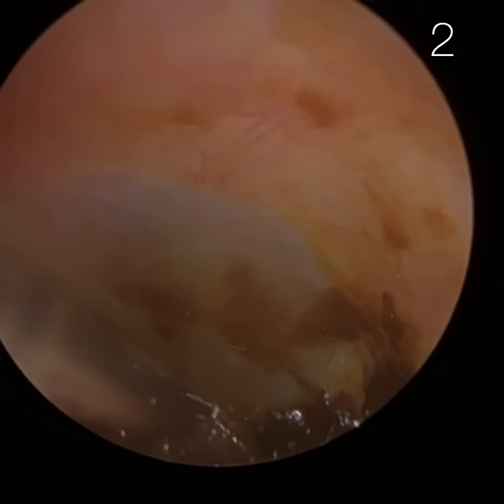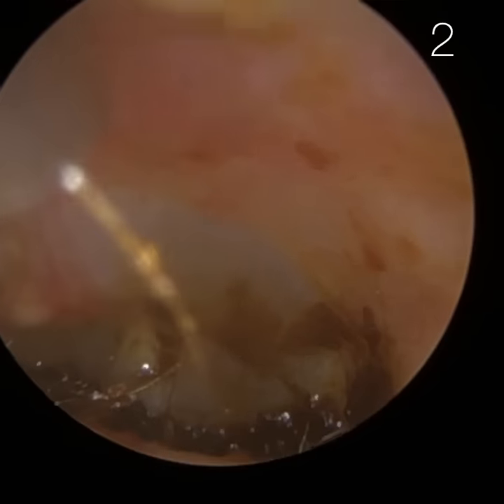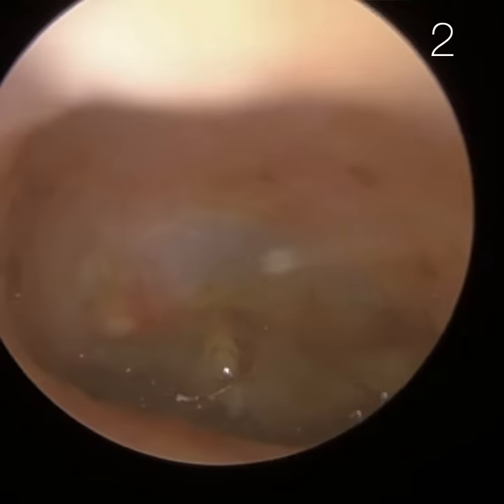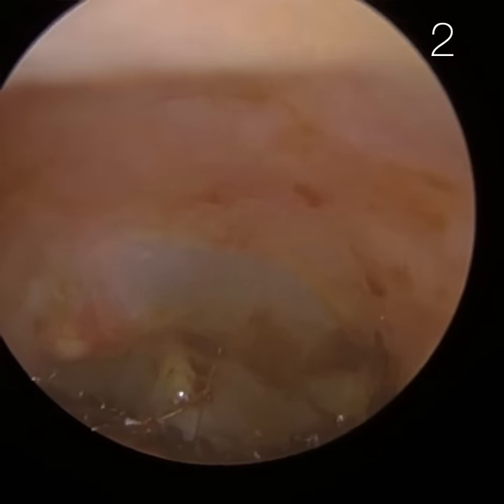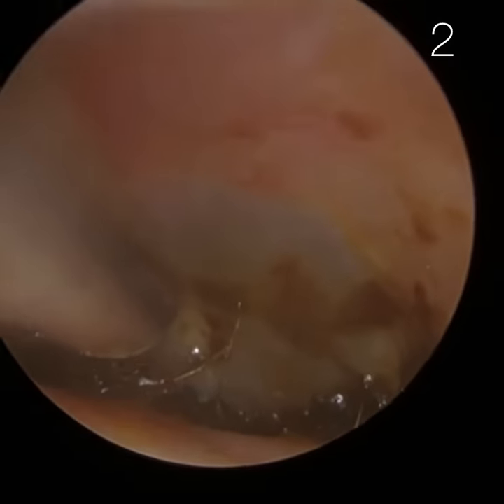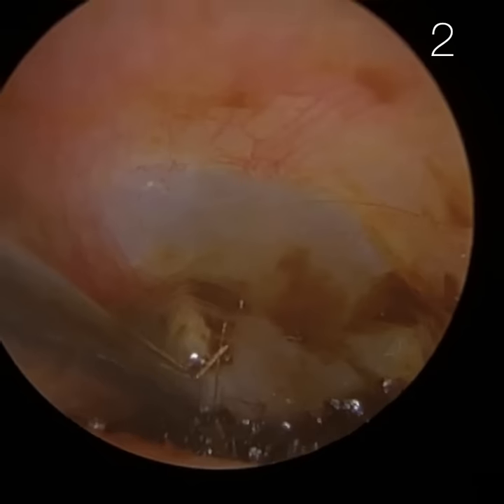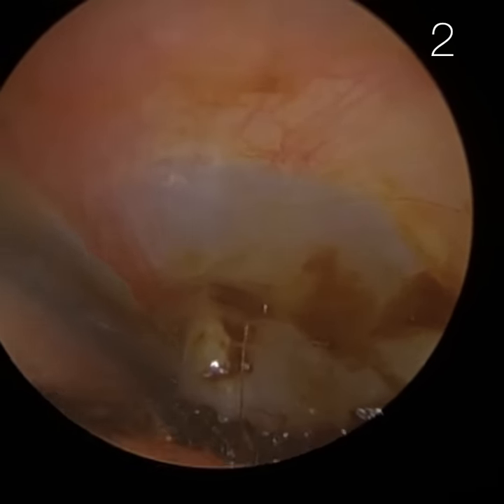Using the fine end, I have to bend it just to get access because the ear is so bendy, twisty, and narrow. We're not going to get all of it out — sometimes we do leave a bit of wax behind. We're obviously doing our best to remove every last speck, but there comes a time when you decide it's always a benefit-risk ratio. We're in someone's ear, vacuuming, and it is a bit noisy.